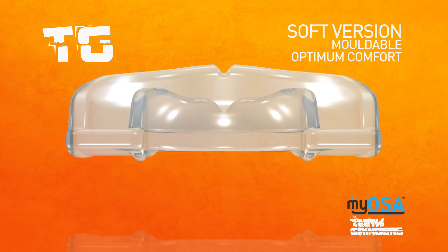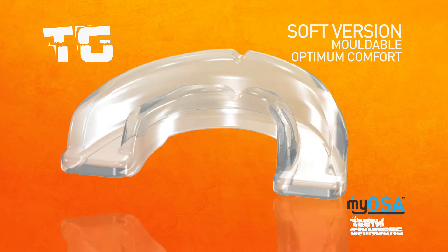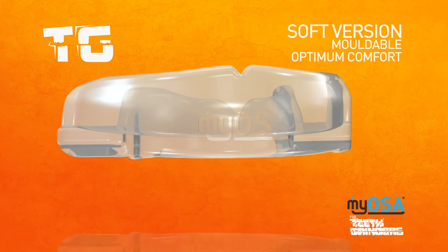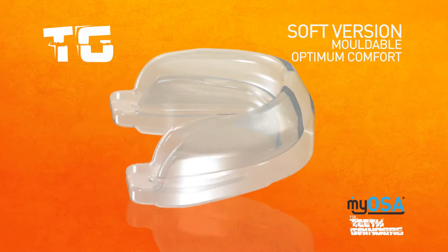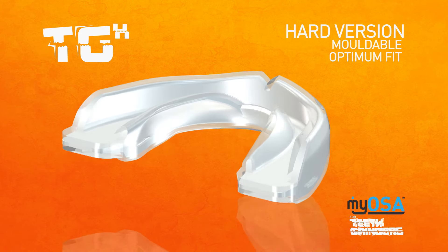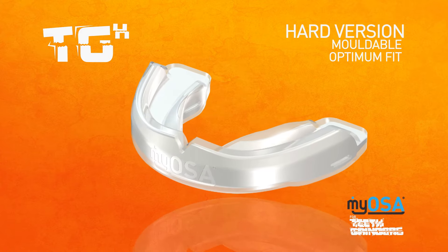The Myosa for Teeth Grinders range includes two appliances: the TG, which is specifically designed to work best for bruxers who do not show any symptoms of TMJ disorder, and the TGH, which is specifically designed for tooth grinders who may also experience symptoms of TMJ disorder.